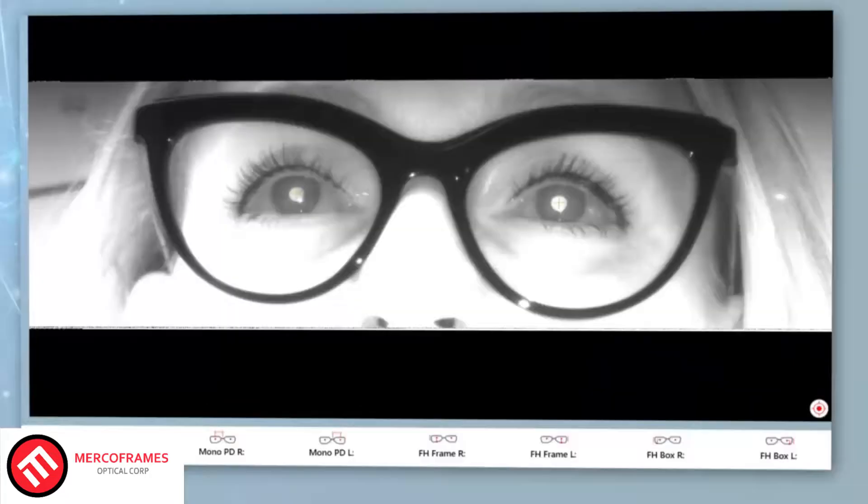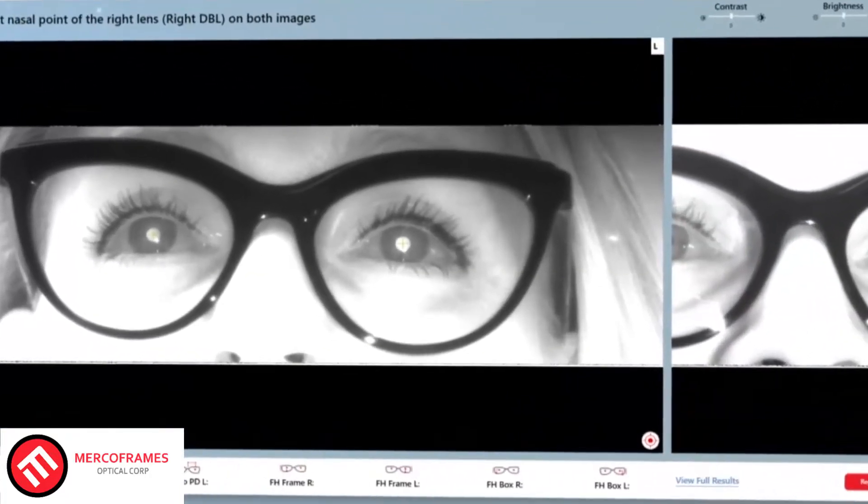You simply click, and Spark Me Up captures the image. Spark Me Up even measures dark glasses, seeing the client's pupils as clearly as if it were clear lenses.